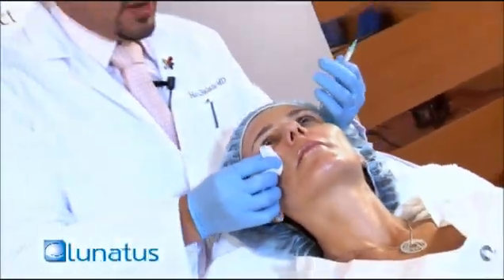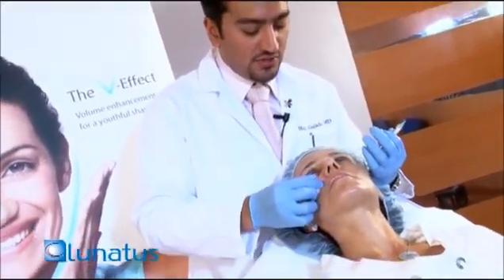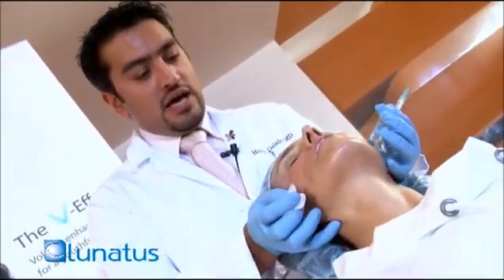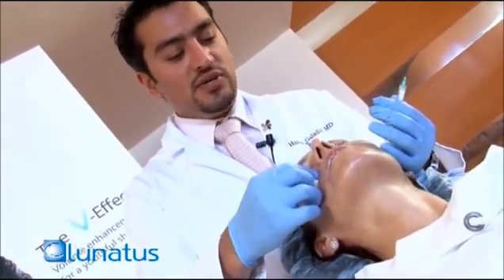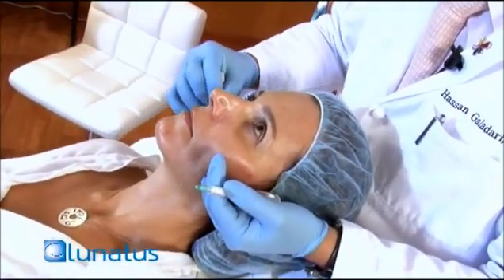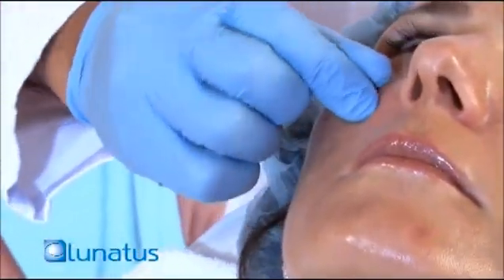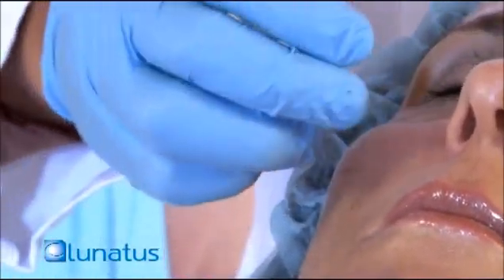Now that I've put in a bolus, I'm basically going to try to massage it into the area. We've injected about 0.5 of the material. I like seeing my patients from different angles. One of the best angles that you can assess patients from is coming from above. Massaging is going to be very, very key. See, I'm pushing the material to go up. While I'm massaging it, I'm pushing the material to go up, right where the defect is.